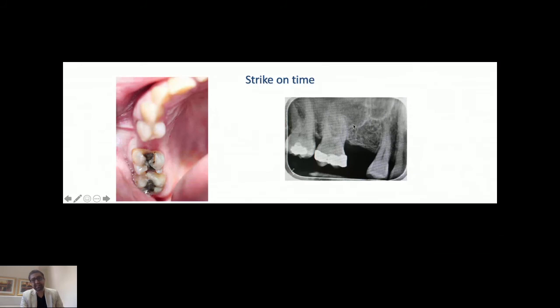This sinus height is about 4 millimeters, and when you take the 6 out, the bone resorption is going to happen in about 6 months to 1 year. This 4 millimeter will become 2 millimeter. And when it becomes 2 millimeter, we are all thinking about lateral window approaches. My plea to you is, why don't you plan and act at this time and not lose the 4 millimeter.